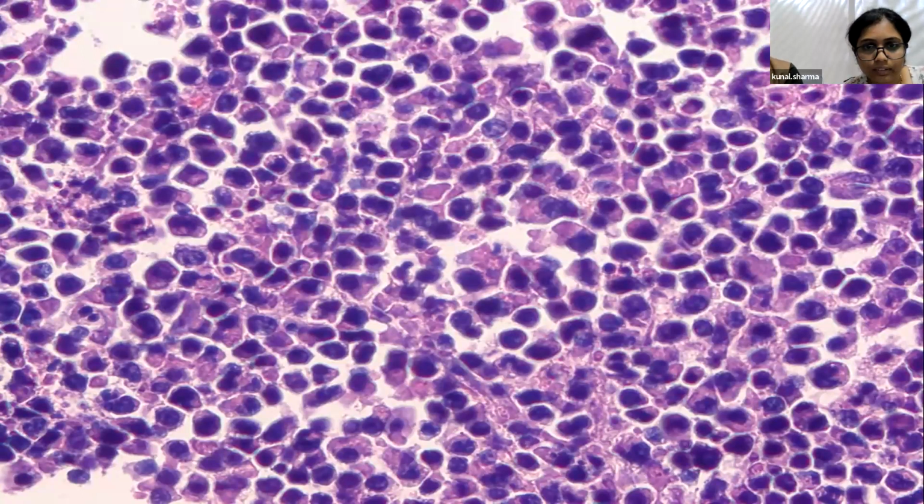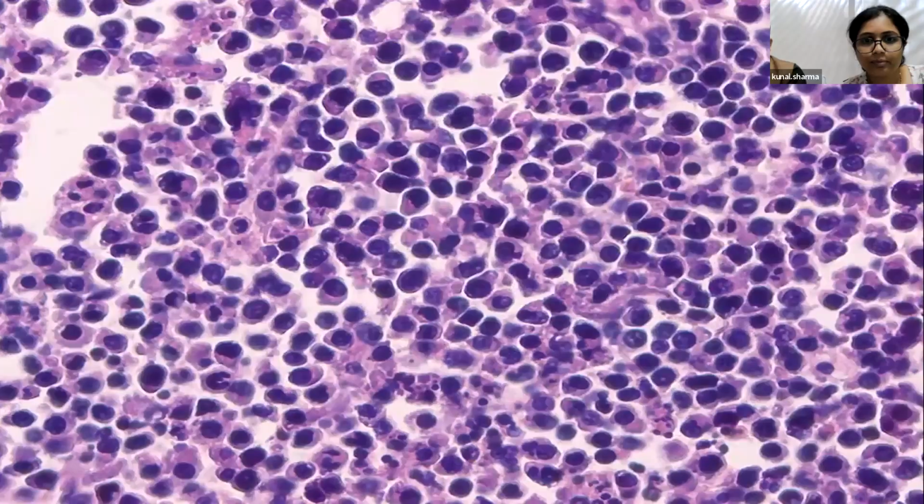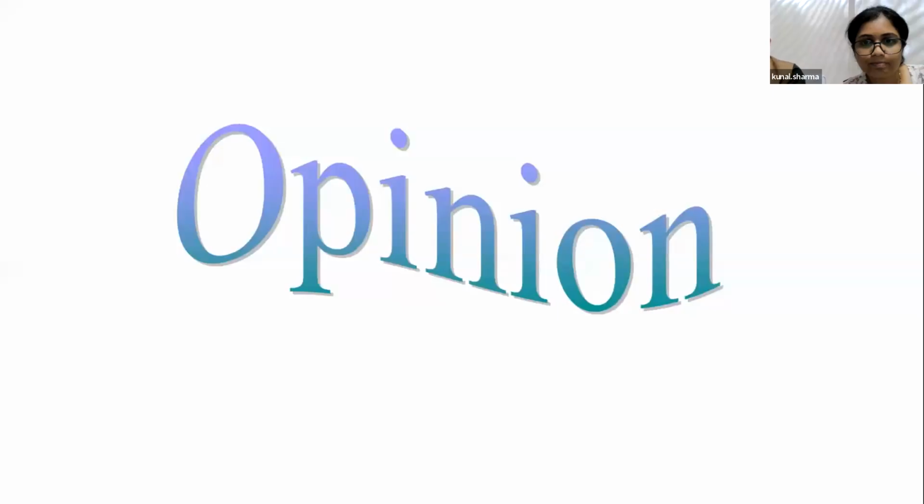Any opinion? After HE, what differentials can you think of? Okay, there are some chat coming up.